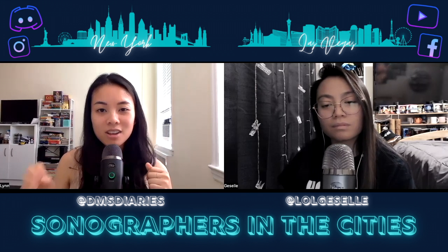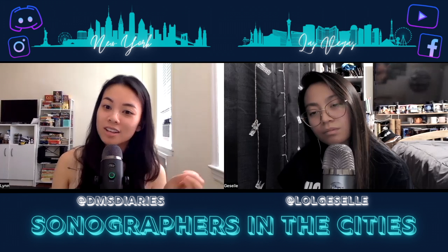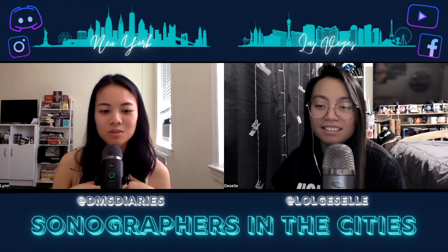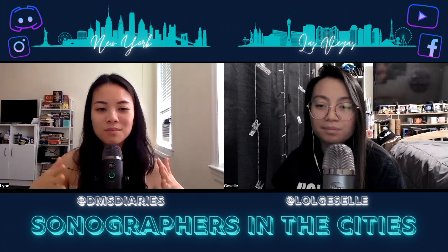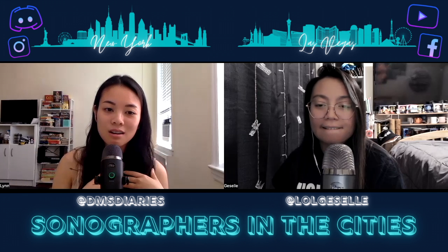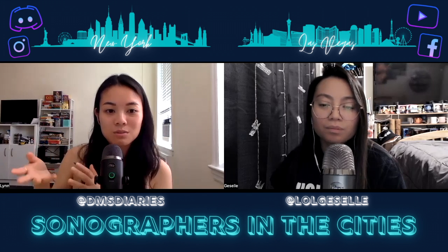And then there is stress echo, which is to see how your heart functions under stress. There are three types of stress echo that I've learned. There's exercise stress echo. They scan your heart at a resting rate, and then you run on a treadmill until you reach your maximum or you're too tired and want to stop. Then they rescan your heart and compare the images of when your heart is at rest and after it's been induced with exercise.